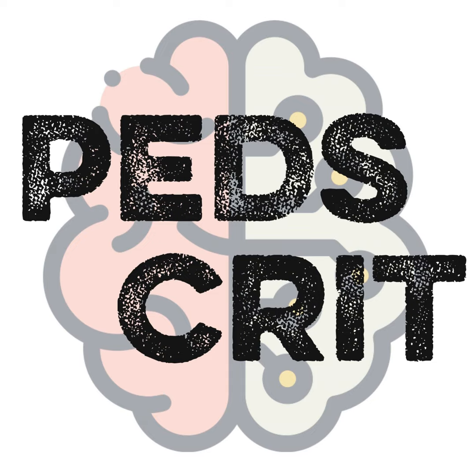So the tidal volume trial compared 6 mL per kilo in adults with a plateau pressure limit of 30 against 12 milliliters per kilogram in adults with a plateau pressure limit of 50. So even in that trial, there's an inherent problem here. The problem is that you're testing a volume thing with a plateau limit. So some of those concepts of stress and strain are being kind of mushed together.